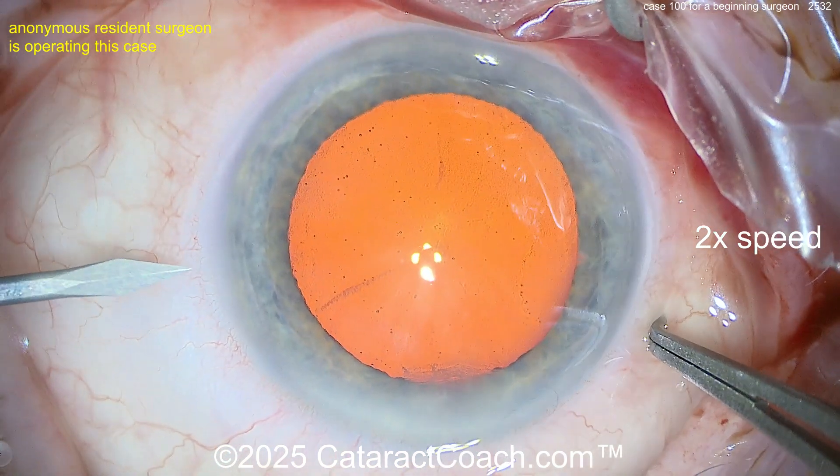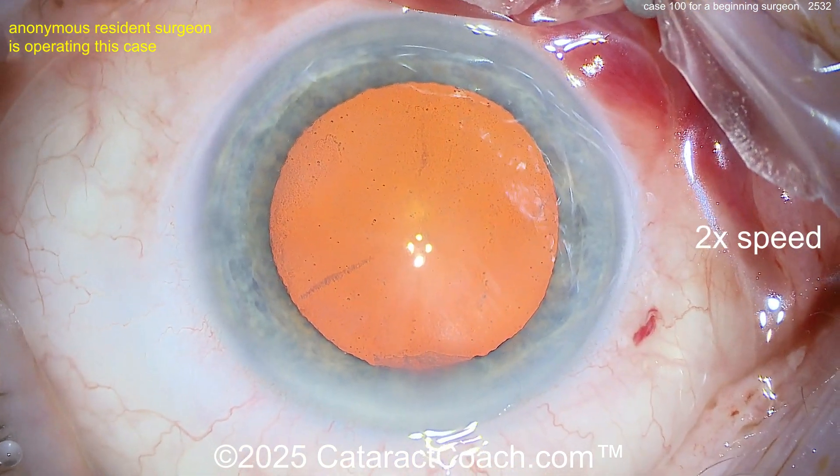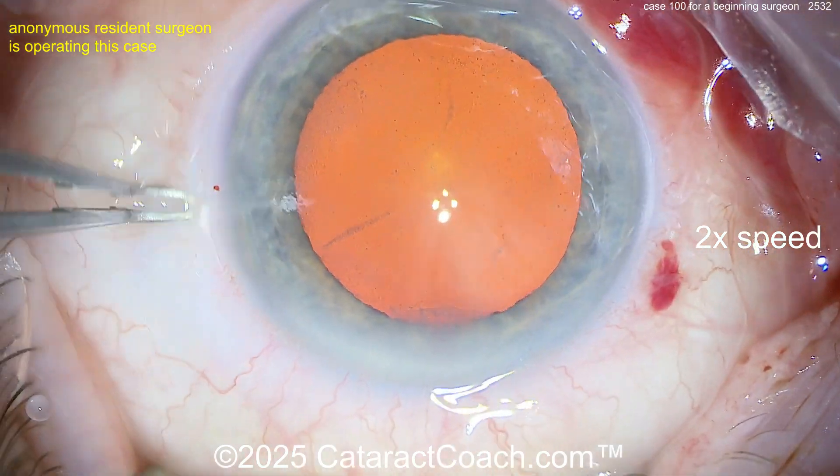Here's the viscoelastic inside the eye. Look at the incision — I don't like it. A little bit of a chevron shape, a little bit ugly. Here comes a paracentesis — that looks reasonable.